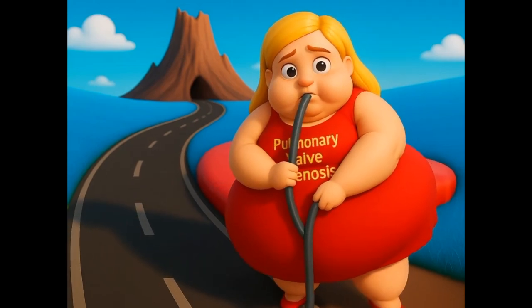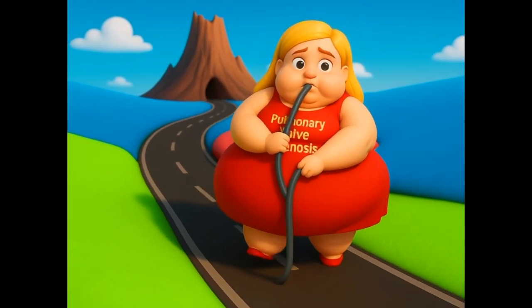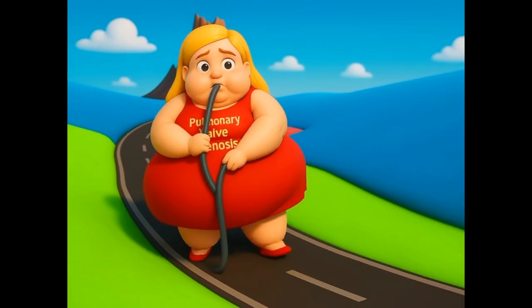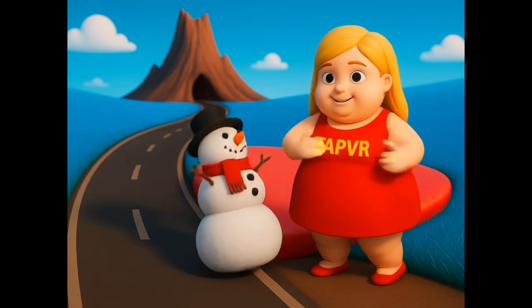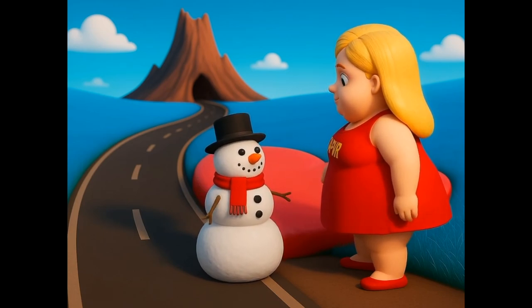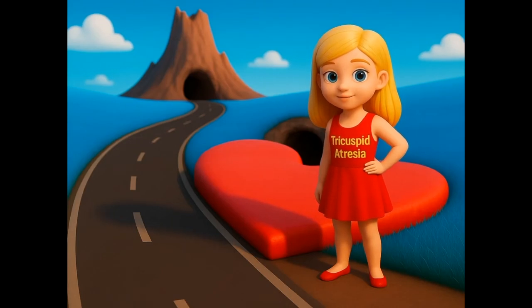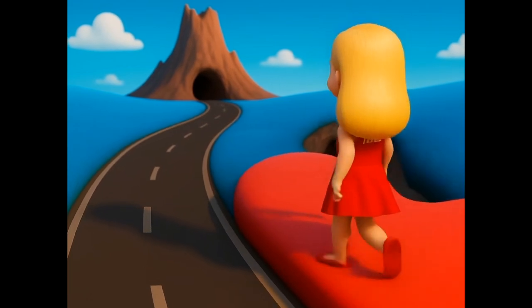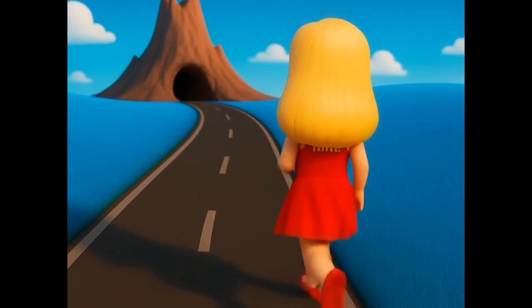Pulmonary valve stenosis causes the main pulmonary artery to enlarge. Chest X-ray shows a bulging artery segment. Heart size stays normal, unless severe stenosis leads to right heart failure. In TAPVR, chest X-ray shows a prominent pulmonary artery, right heart enlargement, and sometimes a classic snowman sign. If obstructed, pulmonary edema with diffuse haziness appears. Tricuspid atresia is congenital. On X-ray, the main pulmonary artery is small or concave due to reduced flow. The heart is usually normal-sized, with reduced pulmonary vascular markings.